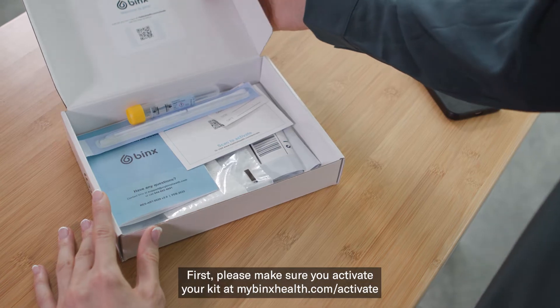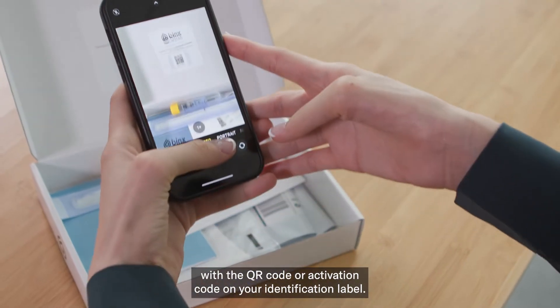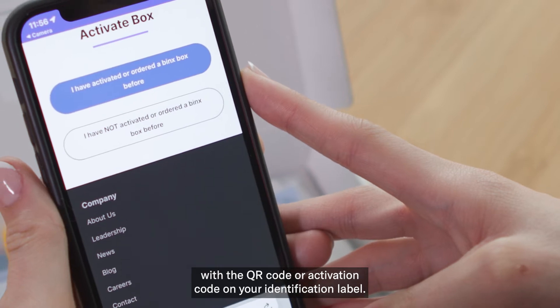First, please make sure you activate your kit at mybinxhealth.com forward slash activate with the QR code or activation code on your identification label.